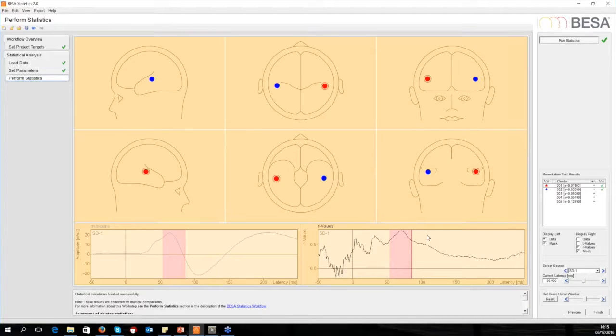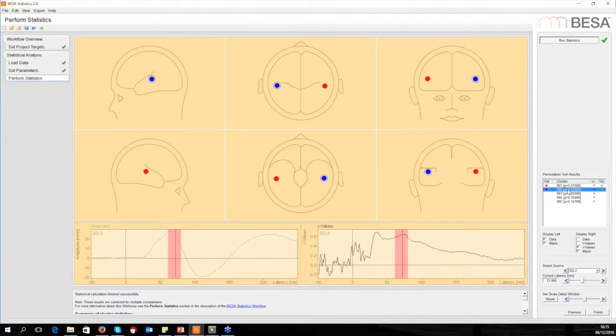So this is even before the N100 or N150 comes into play. And this is actually the only time where there's a significant correlation between this aptitude and auditory response. That's exactly what Peter Schneider also published in Nature Neuroscience, which was against earlier theories that the very early processing steps are the same in basically every human.